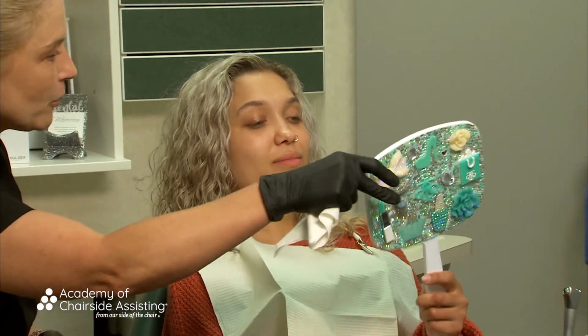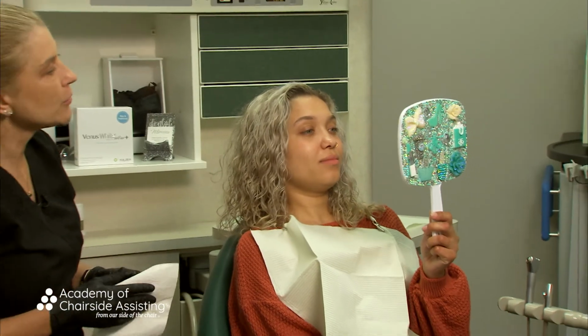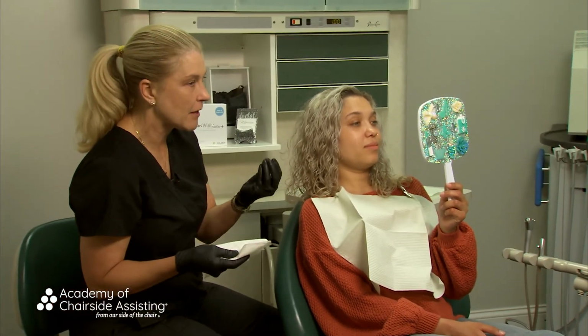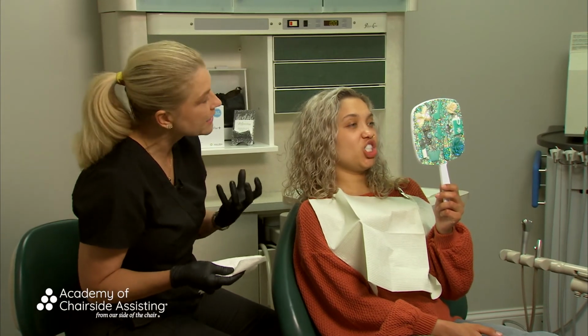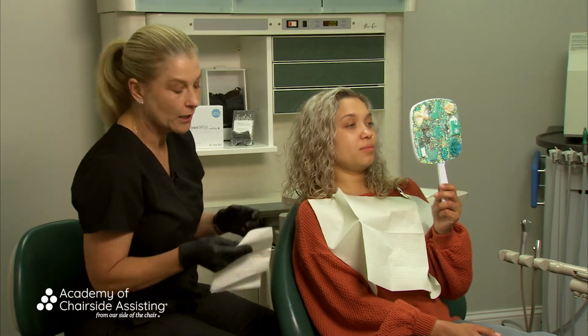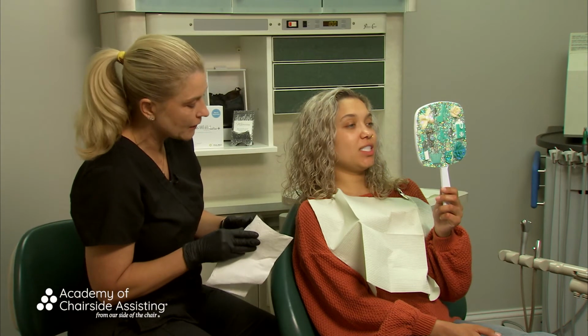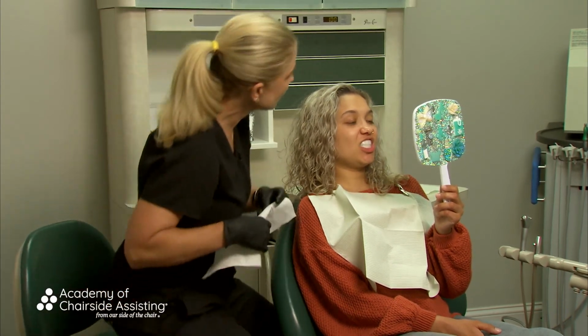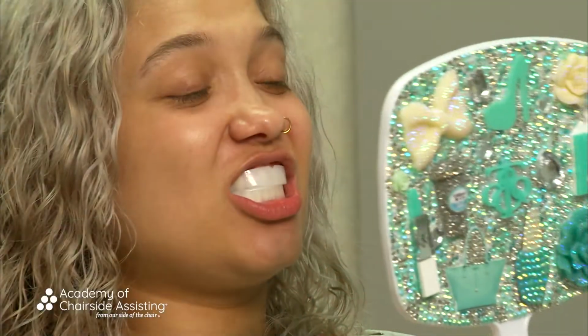It's been 20 minutes. Haley, I'm going to have you hold that mirror for me, okay? This is exactly what you're going to do, and it's going to be a little bit gooey, because what happens when we put the tray on the teeth, the whitening agent is going to kind of melt into the teeth, which is what we're looking for. So when I pull it away, it's going to kind of be gooey. Now, when you're at home, when you take this tray out, what you're going to do is you're going to brush your teeth really good and get all the bleach off.